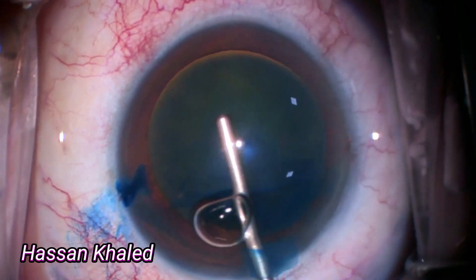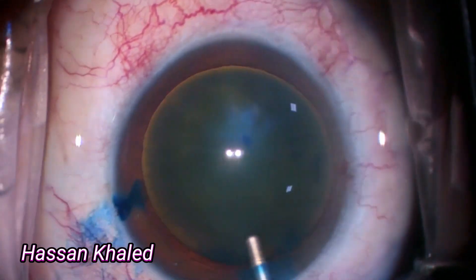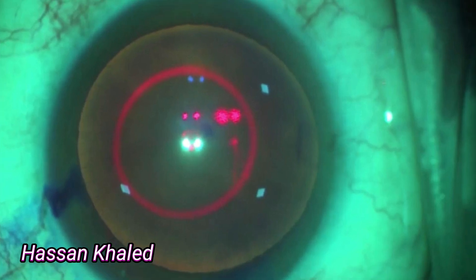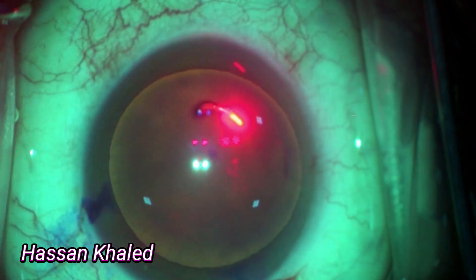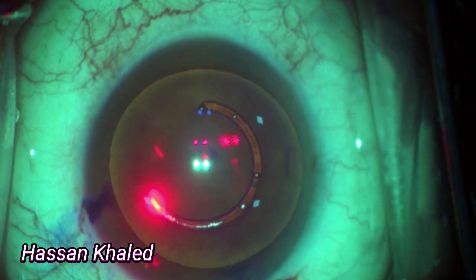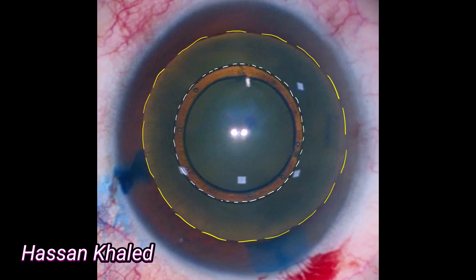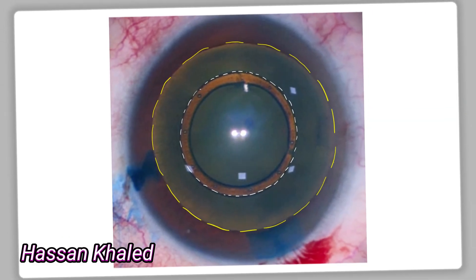Now the triband central landmark is very clear and visible. You can see the circle of the laser centered concentrically with the TCL. Look at the beautiful 360° capsulorrhexis, well centered with the TCL. Look here at the difference between being concentric with the TCL versus with the pupil diameter.